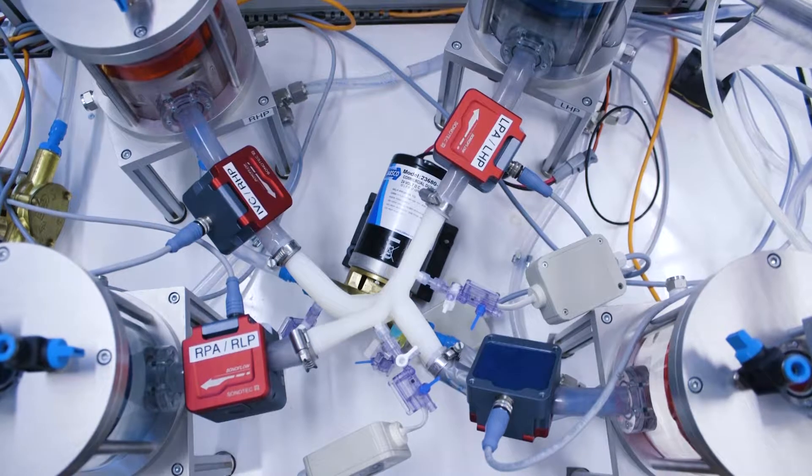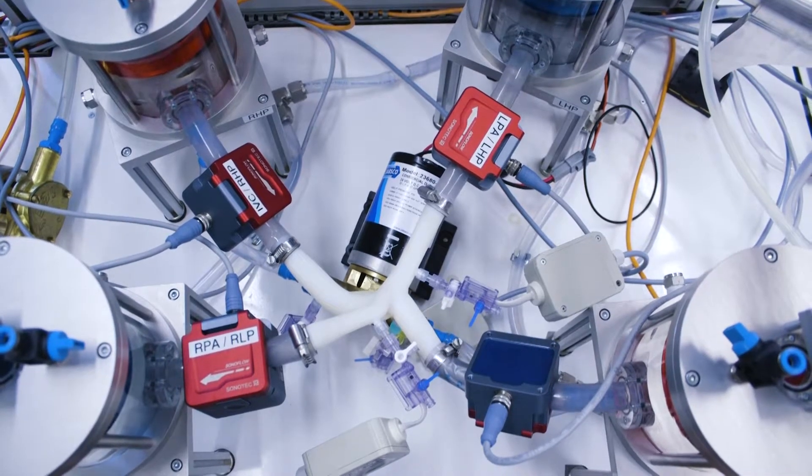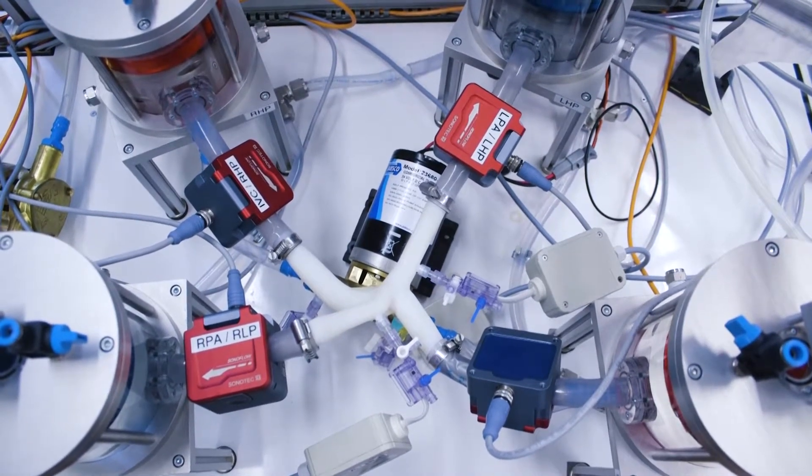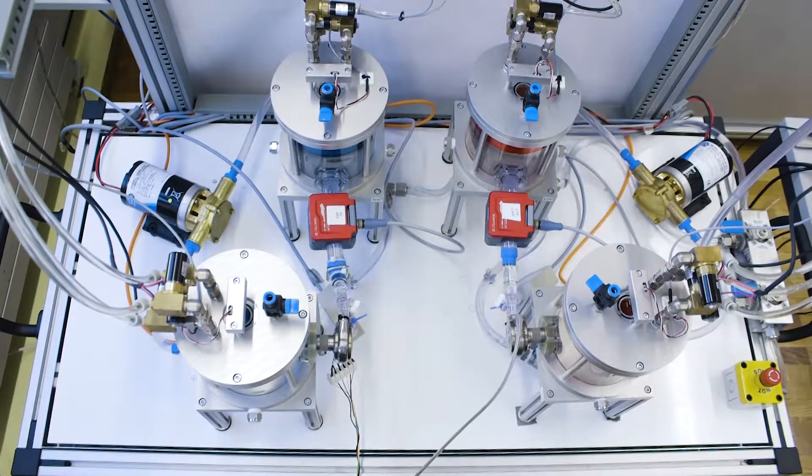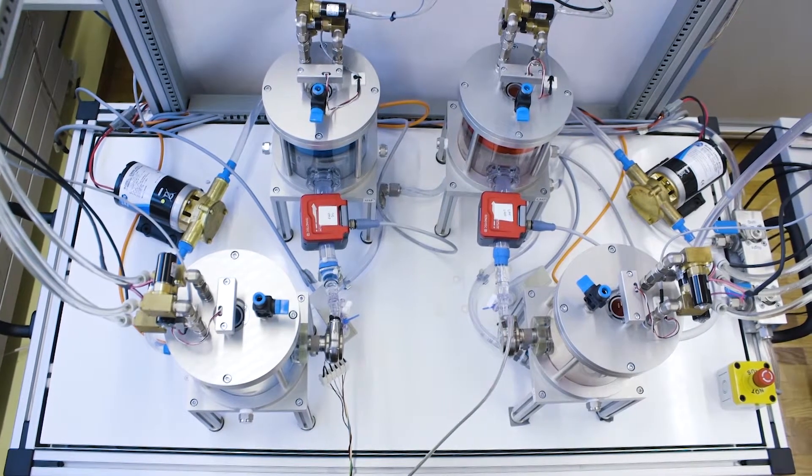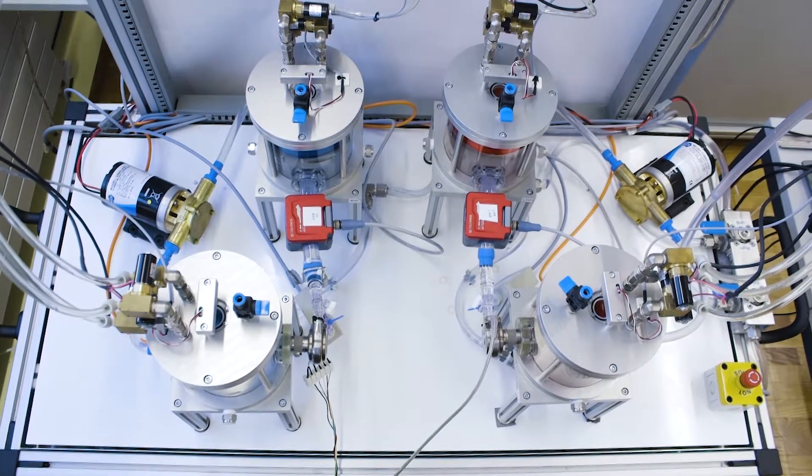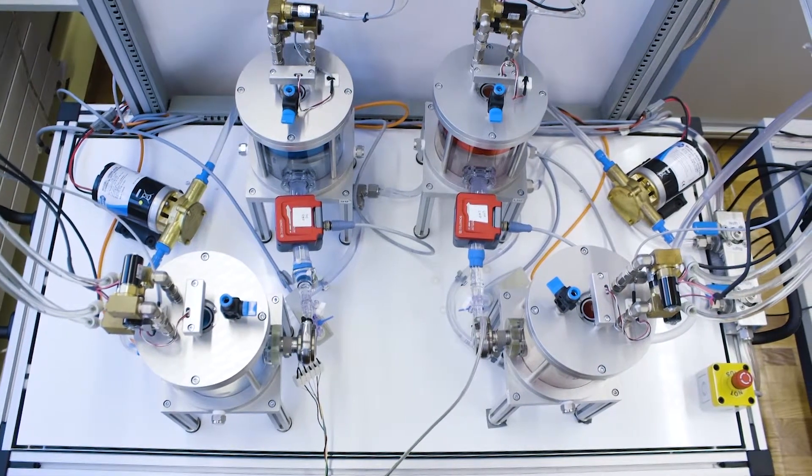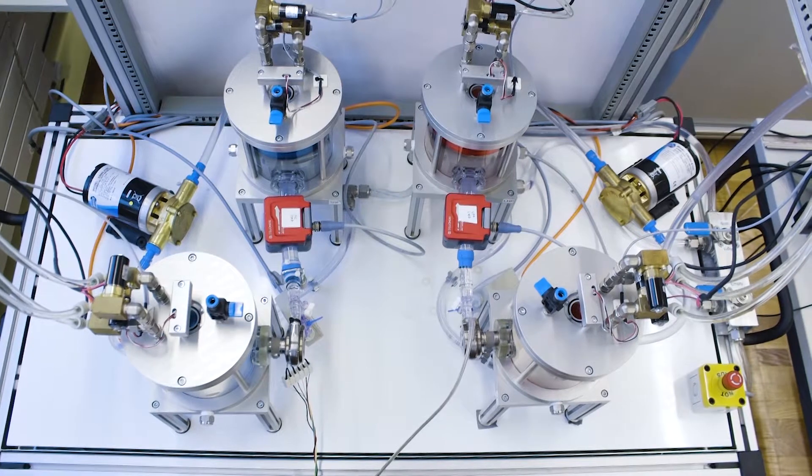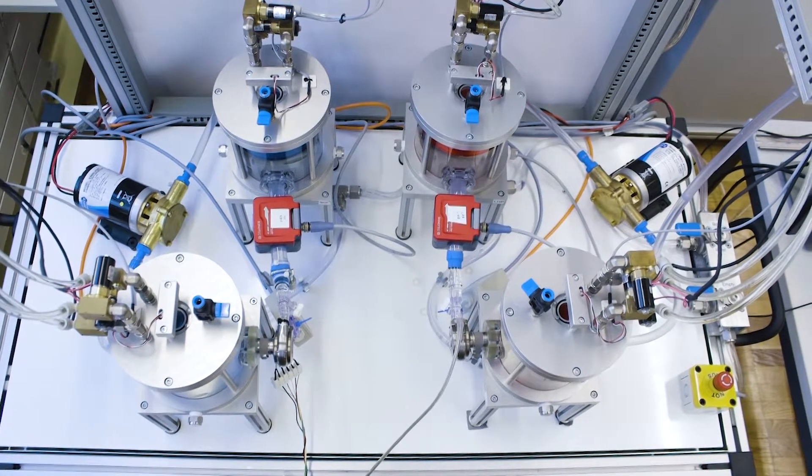In addition, it also supports testing of passive implants like valves or grafts. Not only implants can be characterized, but also new control approaches like physiological controllers that allow adjusting the pump flow to the perfusion demand of the patient.